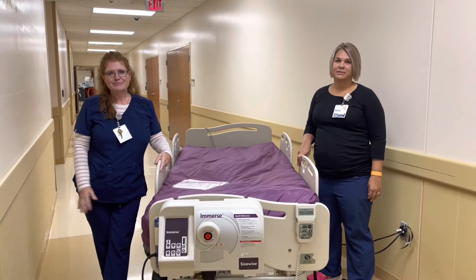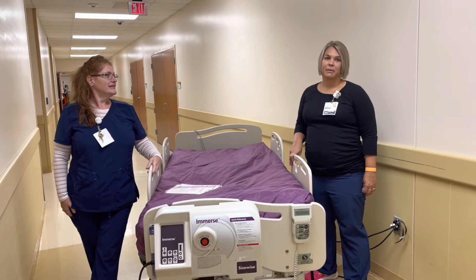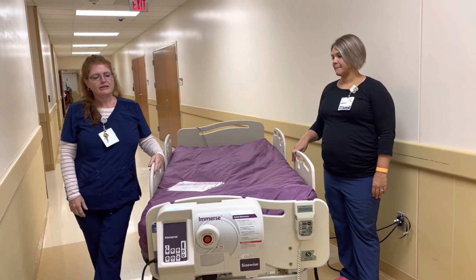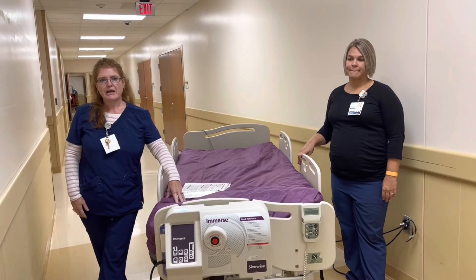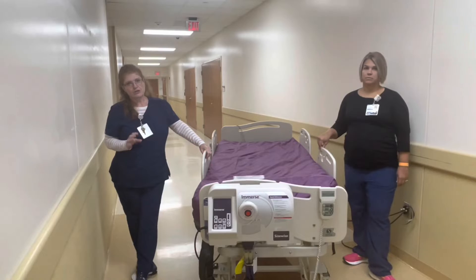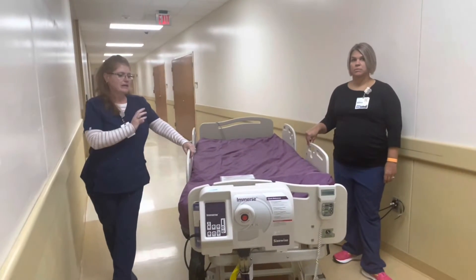Good morning, this is Missy McKenna, I'm with the skin team, and I'm Colleen Mauer, I'm also on the skin team. We are going to talk to you today a little bit about our Immerse bed. This is the Immerse bed — our specialty rental skin surface. First, let's talk about what the indications are to use this bed.